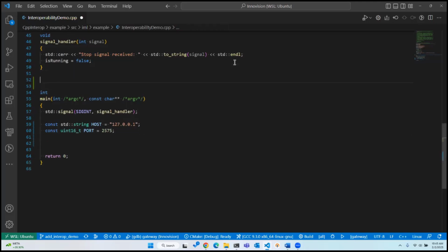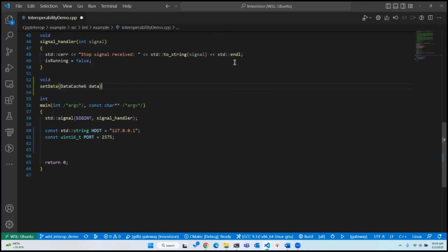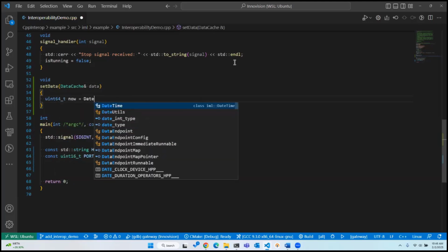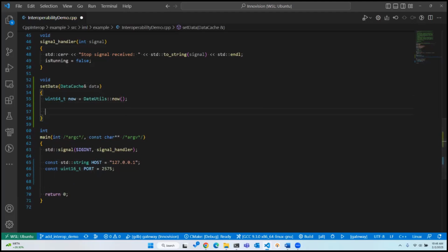So I'm just going to create, at my global scope, a data setter function called setData. And we're going to use the InnoVision data cache. The InnoVision data cache supports monitored values such as measurements, settings, and mode, as well as waveforms and alarms. I'm going to define the time. This is just going to tell the system when we received our data. It's just for the purpose of this example. Your medical device would likely provide this information already.